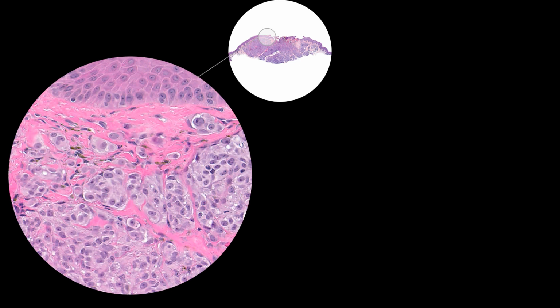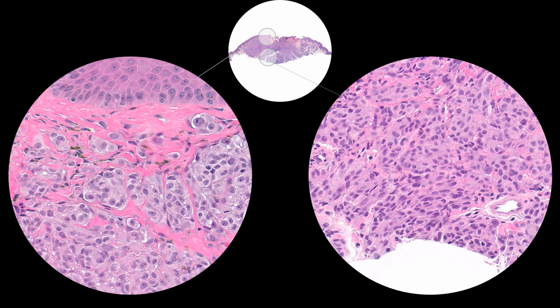And now notice that with a few rare exceptions, even the larger lesional melanocytes have nuclei that are roughly equal in size or smaller than those of the basal layer keratinocytes, and there is a progressive decrease in their average size from superficial to deep. The field on the left is from the uppermost portion of the lesion, and on the right is an area near the base, shown at equal magnification. So there's at least some degree of maturation with respect to cell size from superficial to deep, although not necessarily a decrease in cell density.